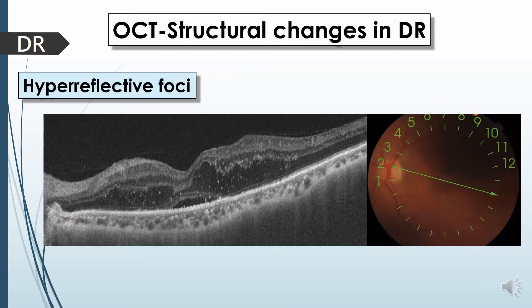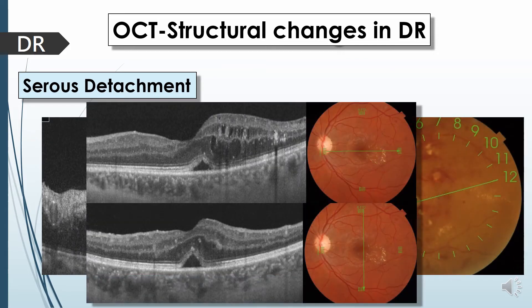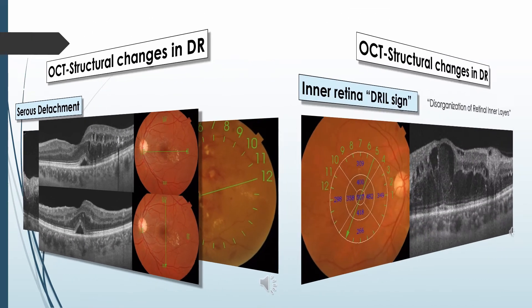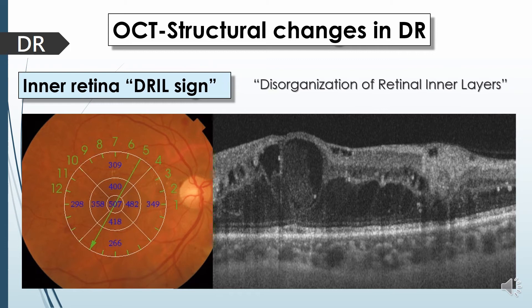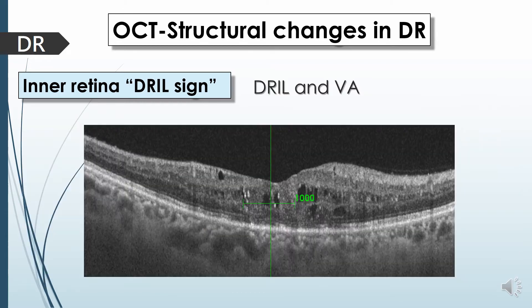Hyperreflective foci may represent subclinical features of lipoprotein extravasation, acting as a precursor of hard exudates, or may represent degenerated retinal cells or macrophages attempting to engulf the cells. Serous detachment represents loss of the outer retinal barrier and appears as clear fluid accumulating in the subretinal space. The DRIL sign, or disorganization of retinal inner layers, is a condition where we cannot distinguish the inner retinal layers from each other, and it carries a poor prognostic value on visual acuity when it involves the central 1 mm region.